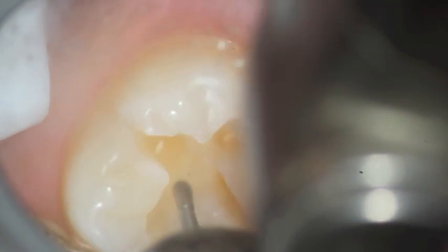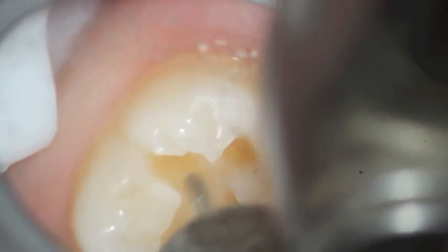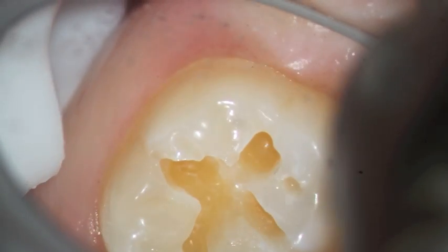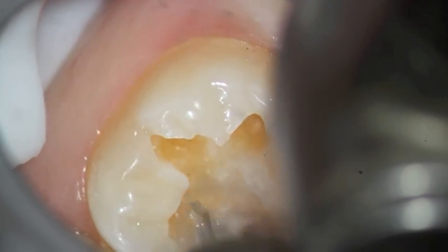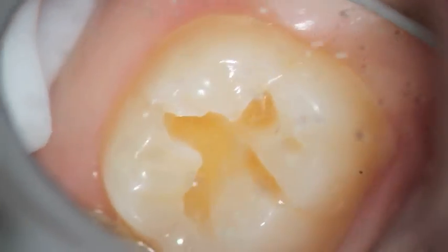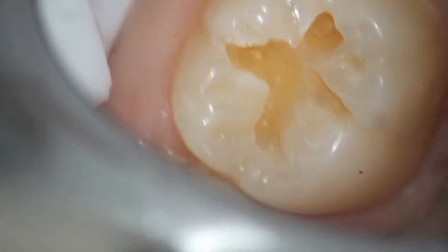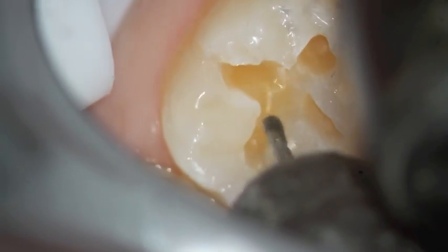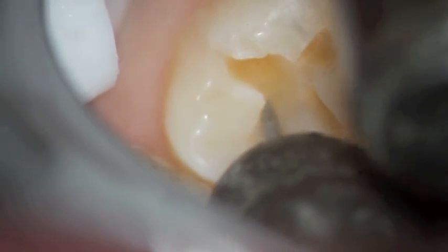And this is the previous burr, and we're smoothing down and removing areas of decay. We don't want any sharp spots on the floor. We'd like to be able to have the filling material flow in smoothly.